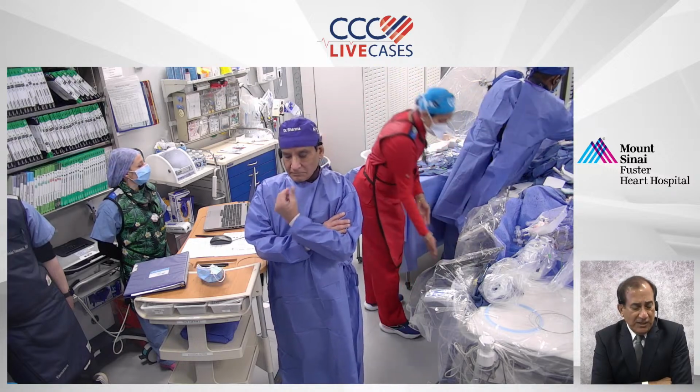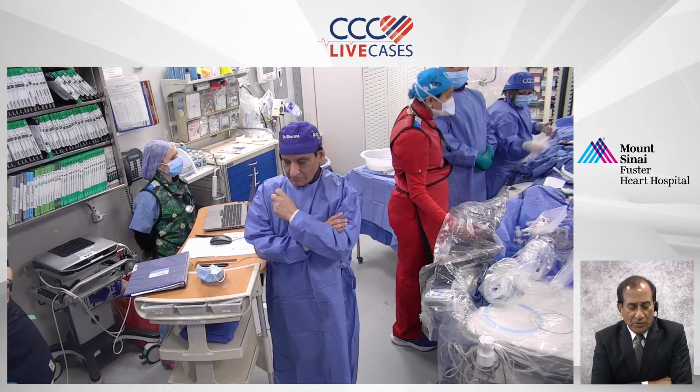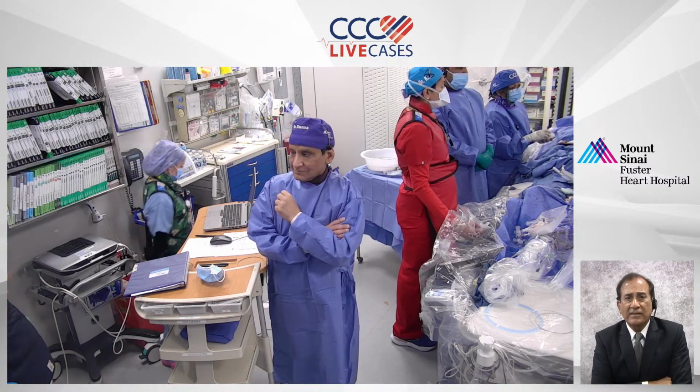Your entire approach, believe me, you made it look so simple, and I tell you, there was a lot more critical thinking and decision making there.